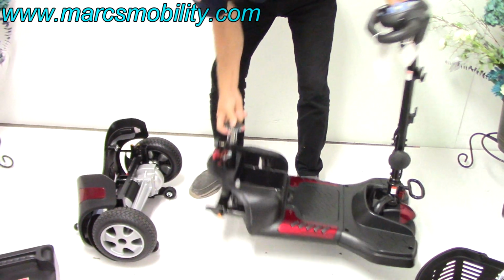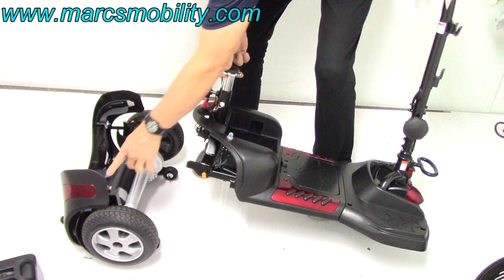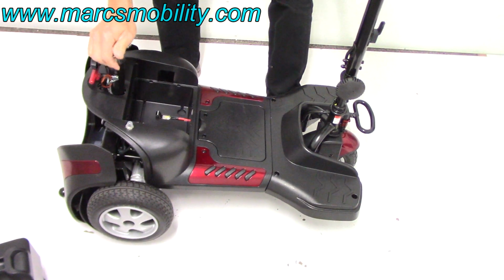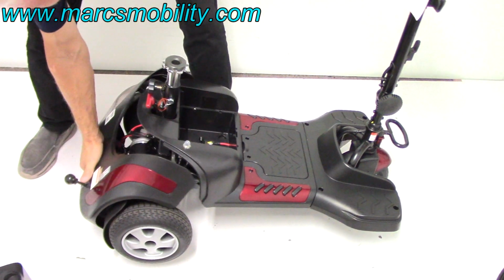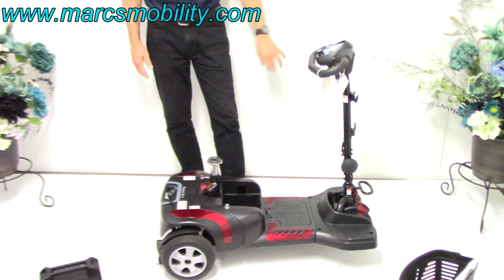Grab your rear end right here, and you can see there's an orange mark right there. There's one on the opposite side, so it has to go in there. So you bring it until both sides are in like that. And I think what we do next is bring it back forward, and it's locked again. How simple is that?